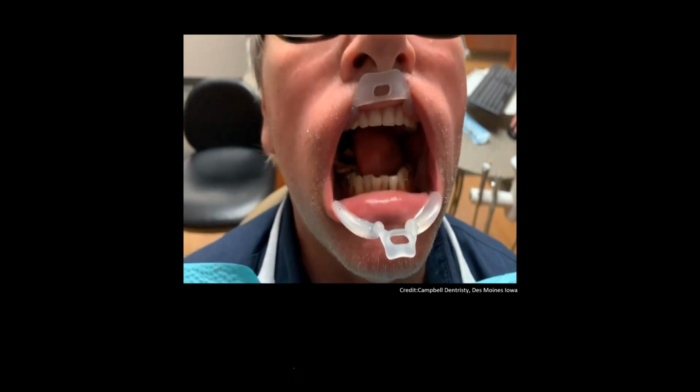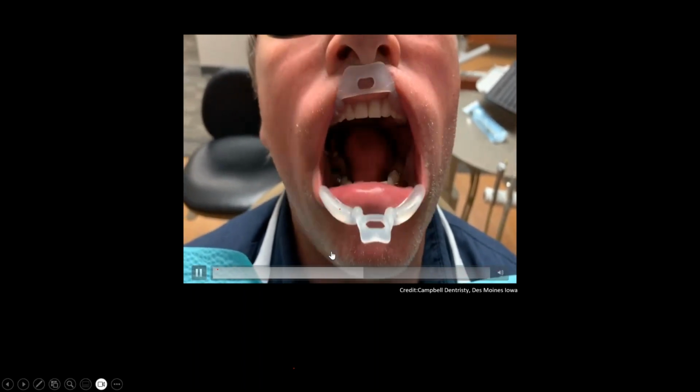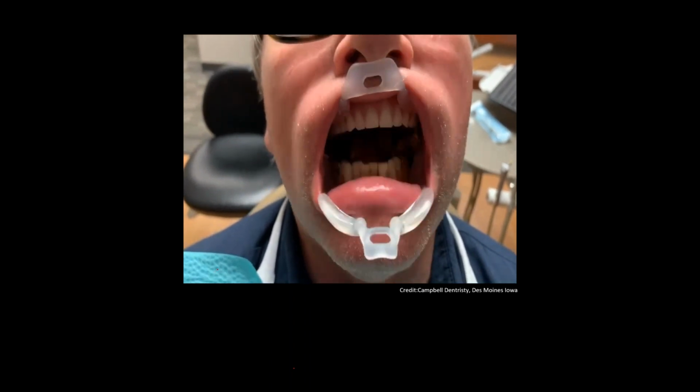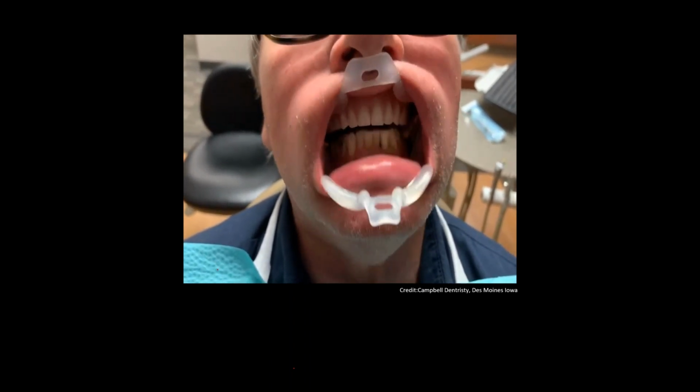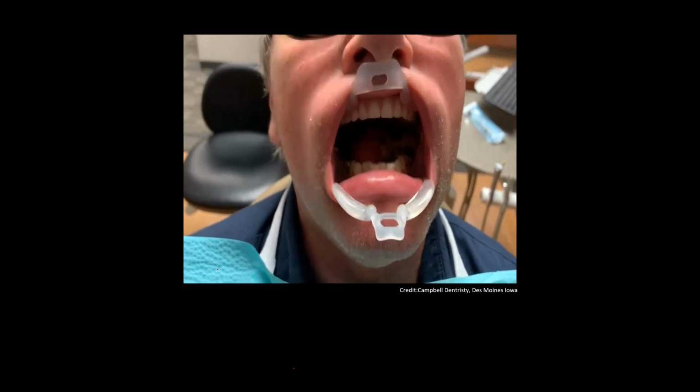Watch him eat. And you can actually see the plate flex in the middle between the centrals. This was after it was repaired. Okay, so when you watch him chew, you can see that he's chewing in a teardrop. And we're asking him to touch all the teeth together at the same time and slide into position. Like, that doesn't work. There's food between your teeth. They can't feel it because there's no nerve.